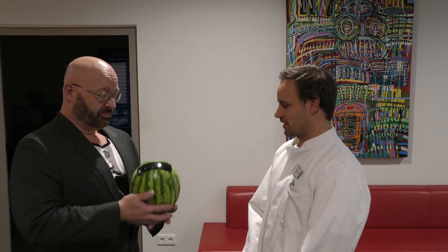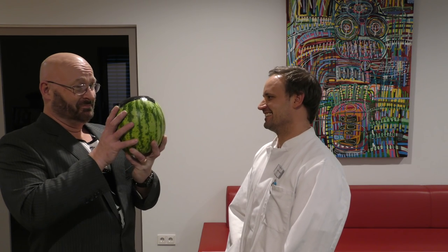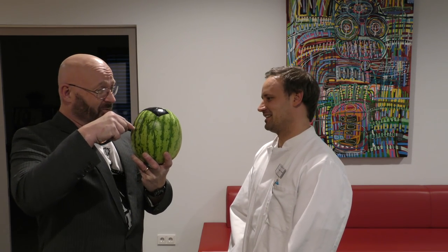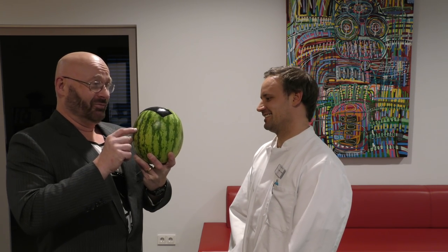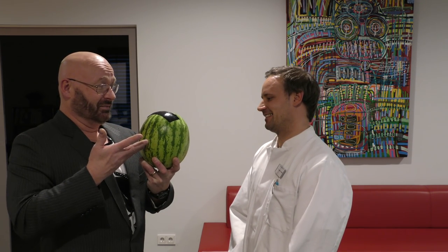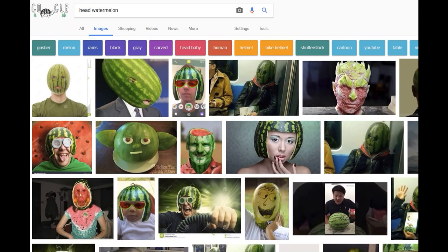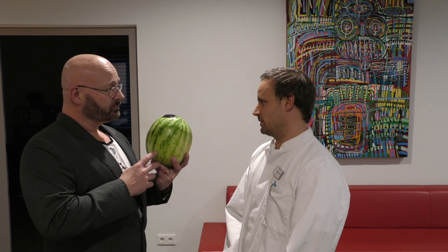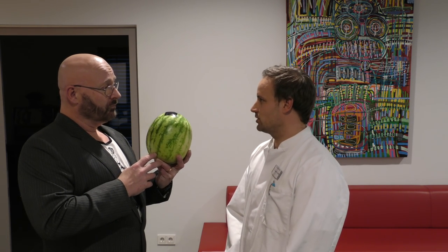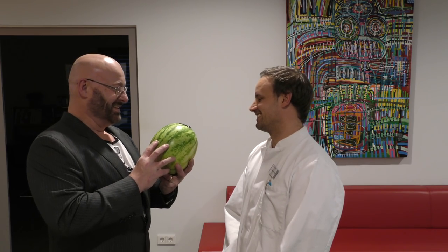I've brought a patient for you — this is my friend the watermelon. Deep inside it there is a tiny piece of beef liver, and of course it doesn't belong to the melon. Can you help? It looks like a head. You can look at the process, the planning for the treatment, and also the radiation of this watermelon.